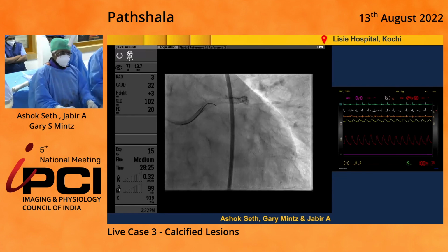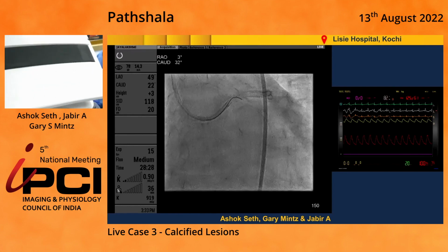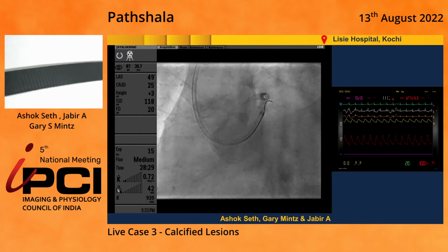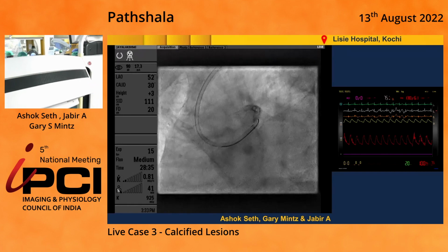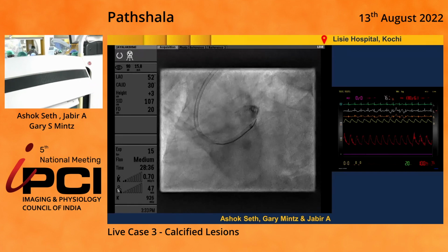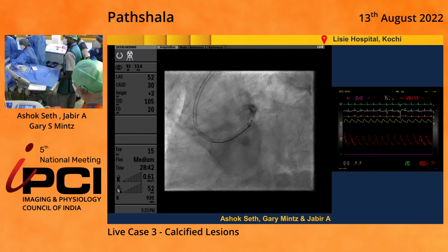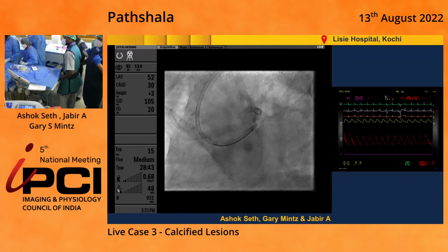While you're doing that, quick question. Ziad, there's only one layer of stent here. What's the likelihood that the shock waves are going to be able to break calcium behind one layer of stent? Actually, it's two layers of stent, because there's overlap. That's where the overlap is. But with one layer, what's the likelihood? And then with two layers?